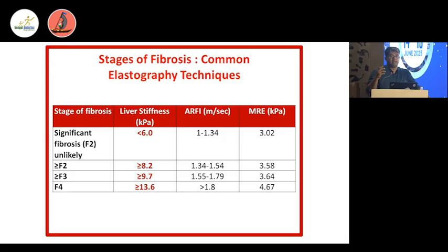If there is external biliary obstruction, and you see on a basic ultrasound that the internal biliary radicals are dilated, do not ask for a FibroScan. If there is hepatic venous congestion, cardiac failure, or renal failure with the patient on dialysis, be very careful, because if the liver is congested, it becomes stiff and soggy, and FibroScan will give you a higher value. If you have a patient with frank cirrhosis, with varices or ascites, do not ask for a FibroScan. It will give you a wrong value. In patients with ascites, please never ask for a FibroScan.